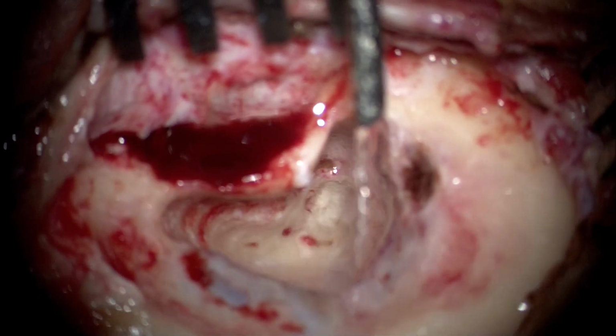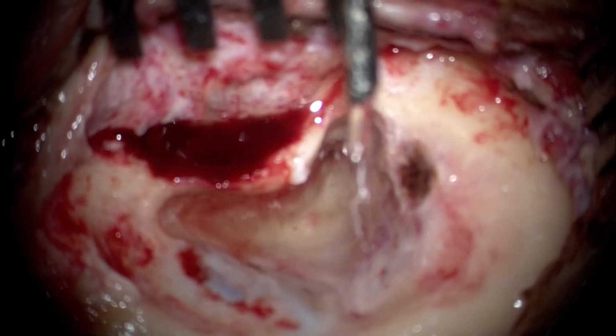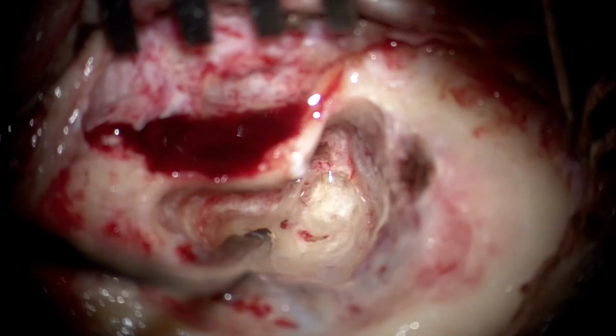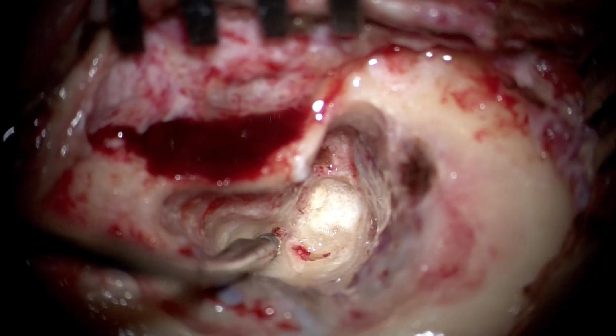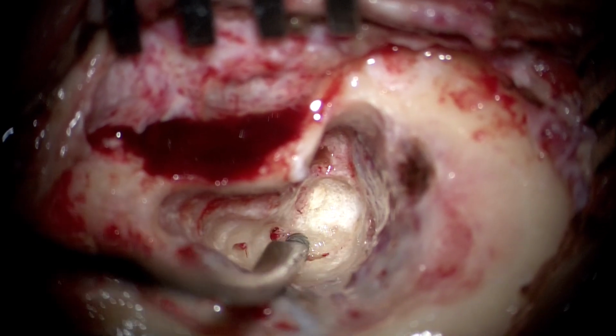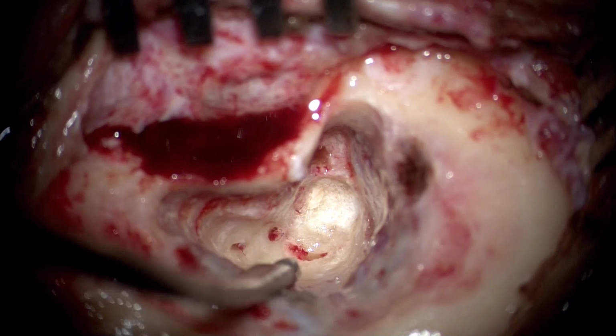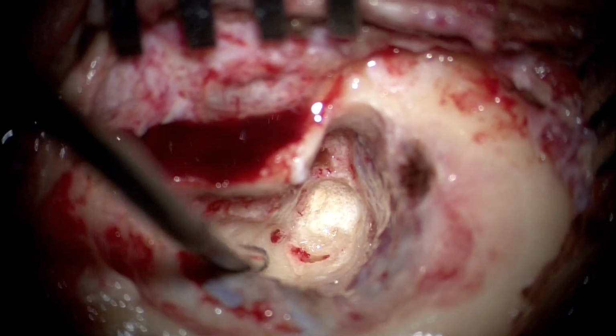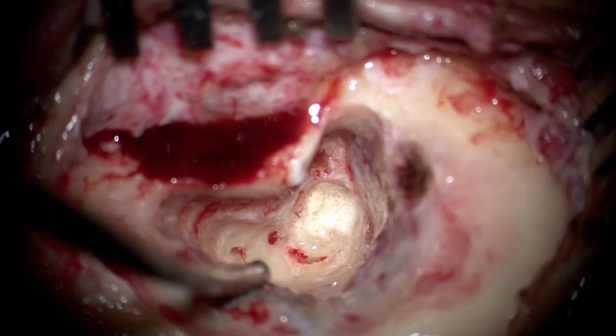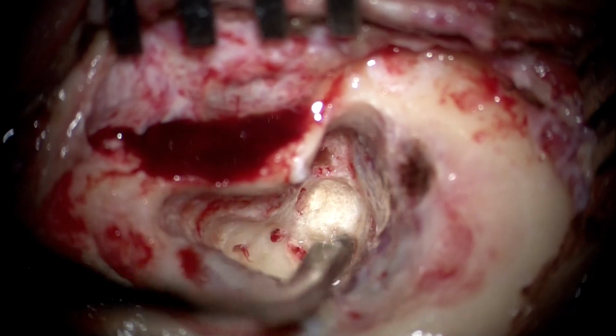One can also see how, as we drill, our suction irrigator, which is relatively broad-based, is dynamically compressing the sigmoid sinus behind us slightly. Any thin suction used here is not all right for this step, because it poses a potential risk to the sigmoid sinus.